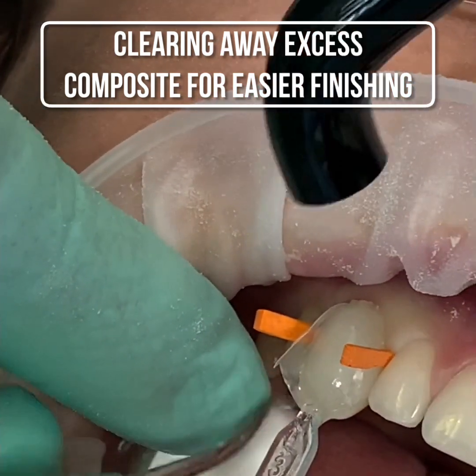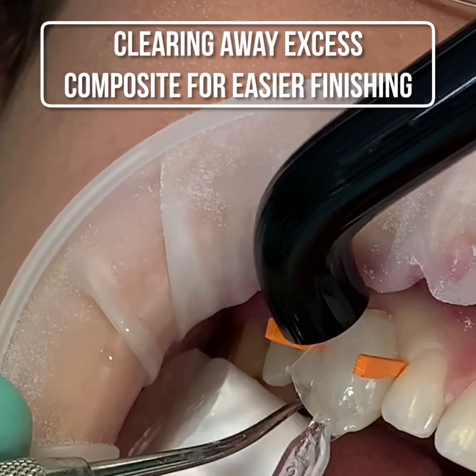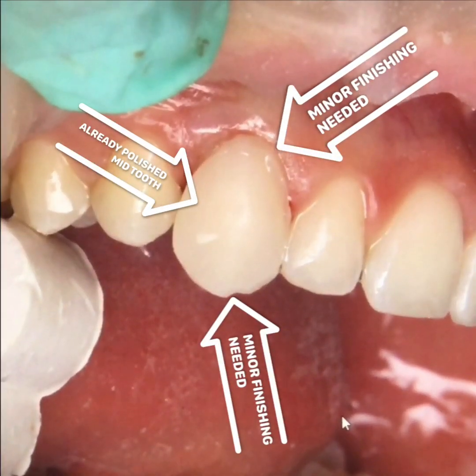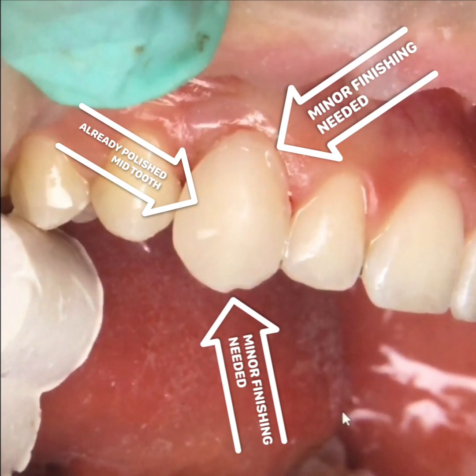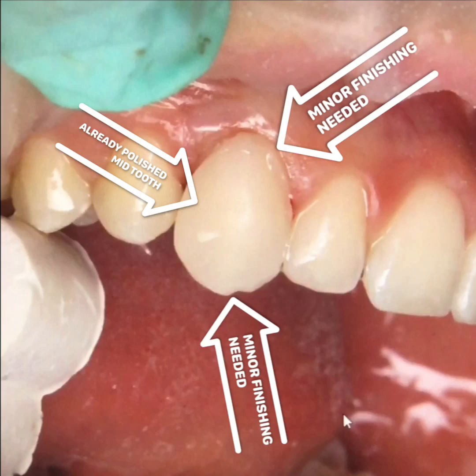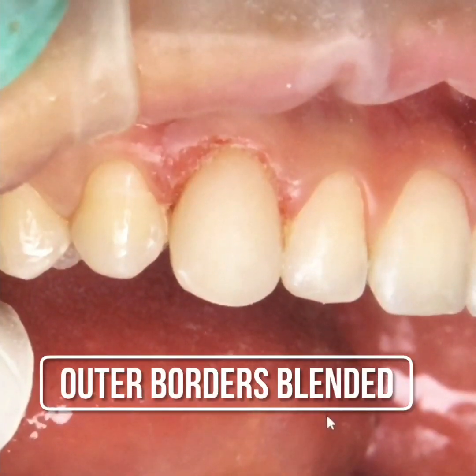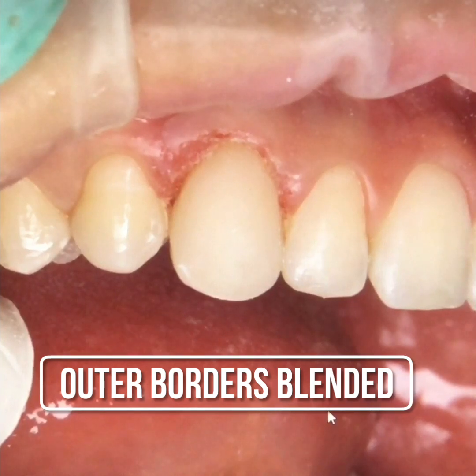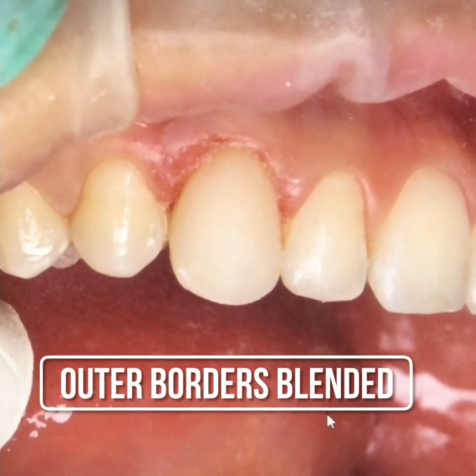And as you'll see when we pull off this matrix, the facial of the tooth is about 75 to 80% finished. There's very little cleanup to do besides shaping, sizing, and then doing a final polish of the areas that you needed to blend in order for this restoration to fit.